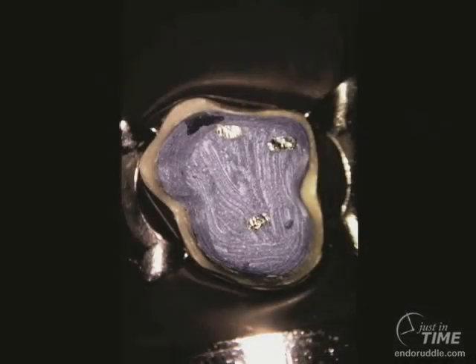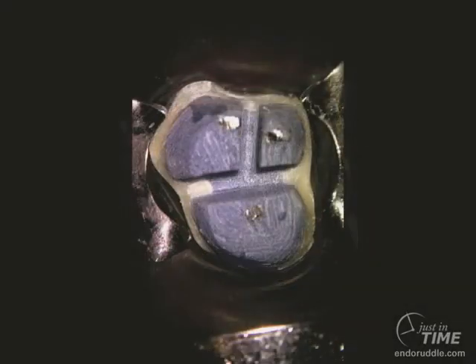The bridge was removed from the abutment to further expose the buildup. The buccal side of the tooth looks pretty much like a normal isolated tooth, but there's quite a protuberance of tooth structure on the mesial lingual side. The buildup should be resectioned in a thoughtful way — I like to divide the post into thirds, making a section buccal to lingual, central to mesial, isolating the three posts with their core materials.